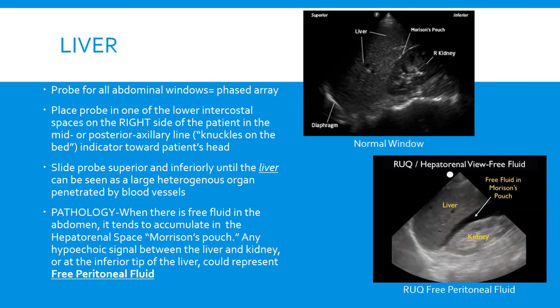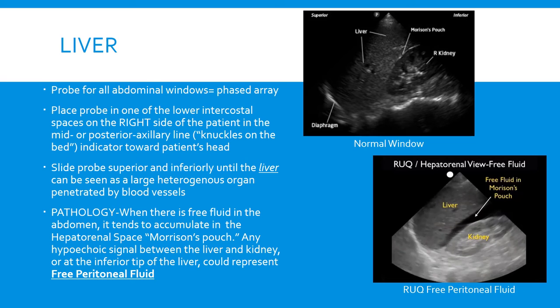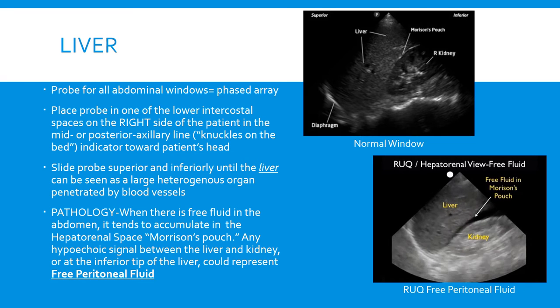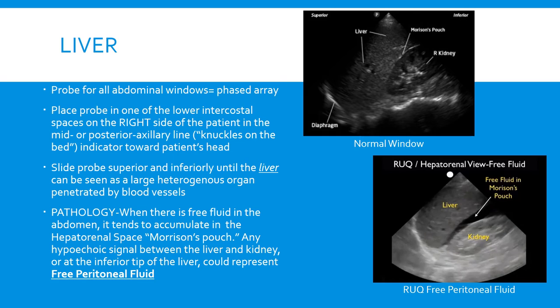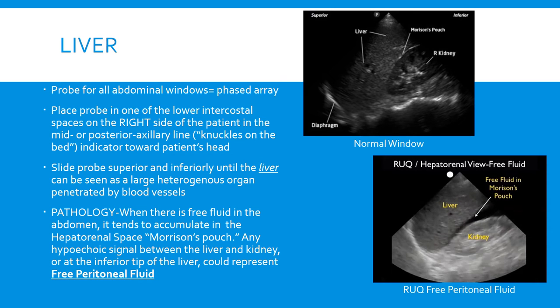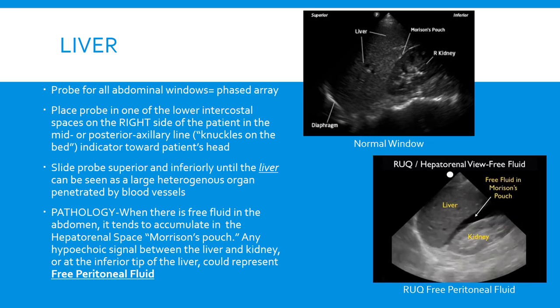For the abdominal views we're going to be using the phased array probe. From our last view we just move the probe a little bit inferior and posterior. A good way to remember probe placement is 'knuckles on the bed,' because you're going to have the probe so far posterior on the patient that your knuckles are actually going to be resting on the bed.